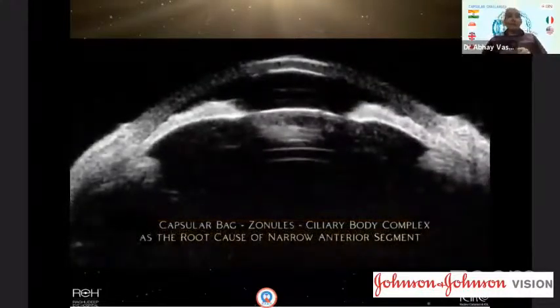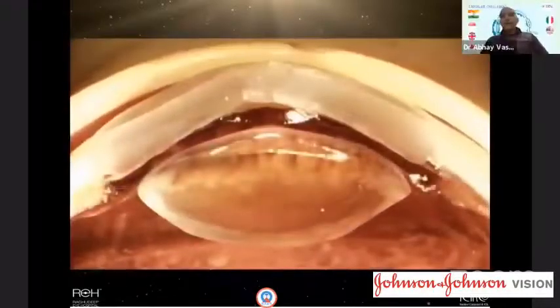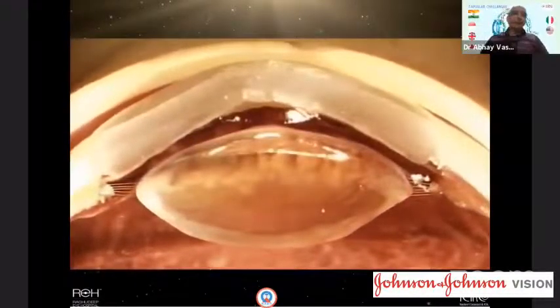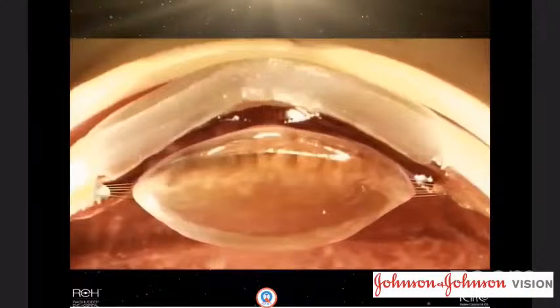Now we believe that this forward rotation is because of the lack of zonular and capsular back support of this lens, which could be due to the ciliary body rotation or a primary event. And I recognize Dr. Kumar here, who really made an award-winning video this time at ASCRS on zonular and zonulopathy.